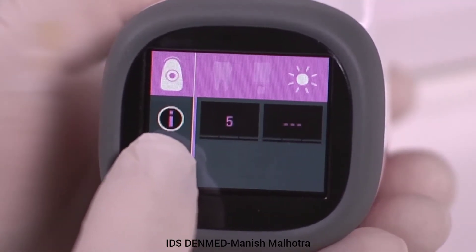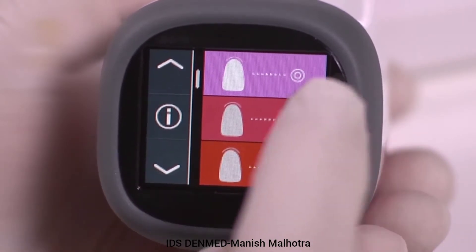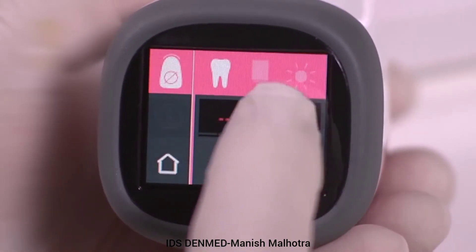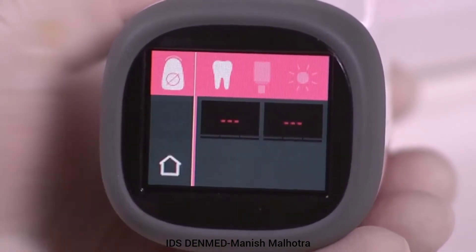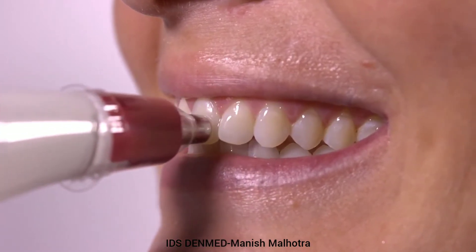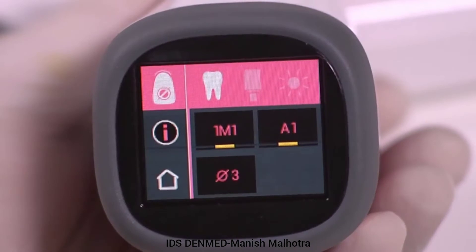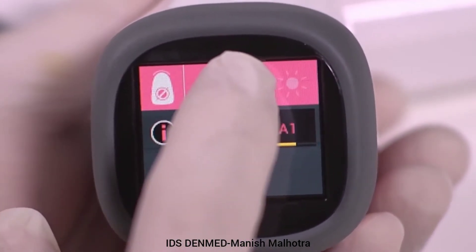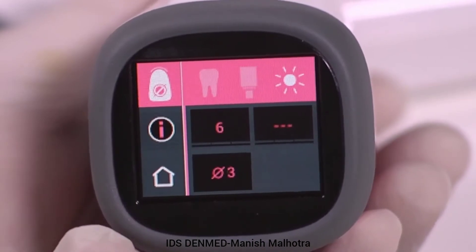Go back to the natural tooth measurement screen and select the average shade measurement tab in the middle of the screen, then select the tooth icon. Up to 30 individual measurements can be taken to produce a mean measurement calculation. The CAD block shade option and the tooth whitening bleach tracking option are also available in this mode.